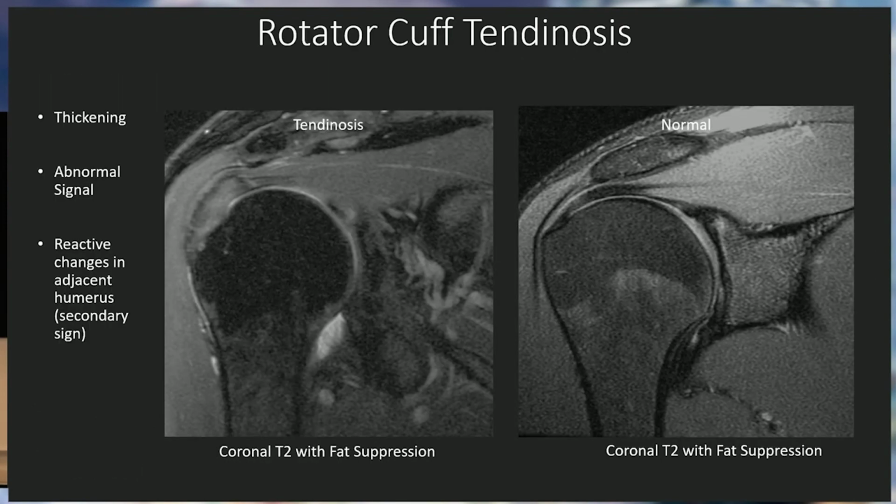The nice thing about imaging tendons is that we're almost always around a joint and almost always around a tendon sheath somewhere. So we have areas where we can look for fluid as our benchmark. We look at the brightness in that joint fluid, or in that tendon sheath, and compare it to the signal brightness in an abnormal tendon. That helps to distinguish if something is tendinosis or tear. That's a generalization, and there are definitely some exceptions, but as a general rule, it's a very good way of approaching tendinosis versus tear. Tendinosis can be thickened, abnormal signal that's not as bright as fluid. A tear is going to show an abnormality that is as bright as fluid. And obviously, if we have discontinuity, it's easy. That's a tear.